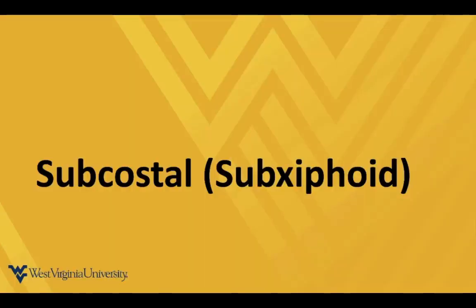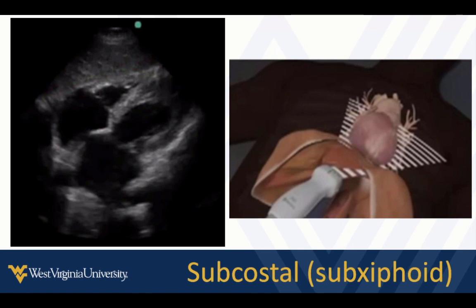The last view we're going to do is the subcostal or subxiphoid view — if you've done FAST exams in trauma, it'll look familiar. In an echo or cardiac setting, our indicator is going to be directed towards the patient's left. We get underneath the xiphoid, lay really flat on the abdomen, and shoot the beam up through the heart. We see this image with the apex on one side, the base back here, right closest to our transducer, and left on the far side.